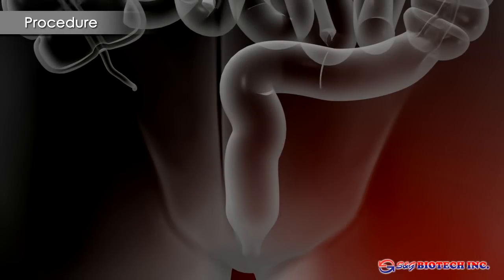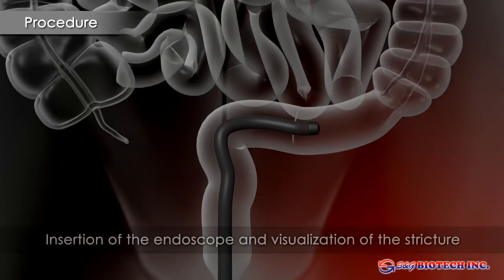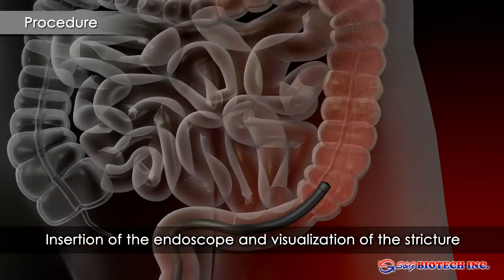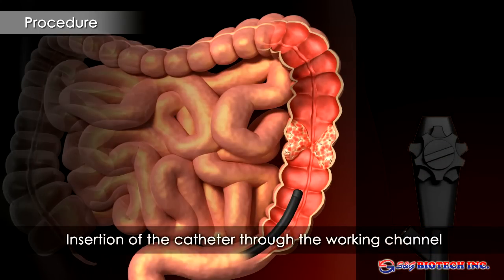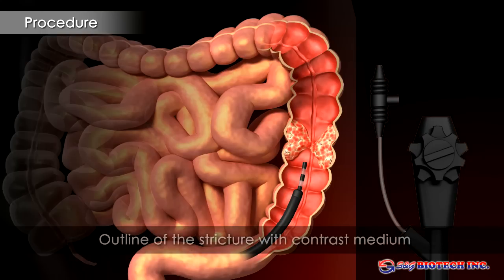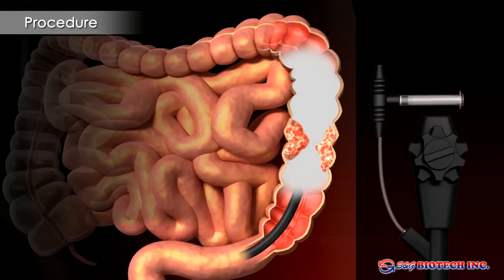The procedure may be performed under endoscopic or fluoroscopic control. This presentation illustrates endoscopic stent placement. A catheter is placed at the lower end of the stricture and a contrast medium injected to identify the position and length of the stricture.